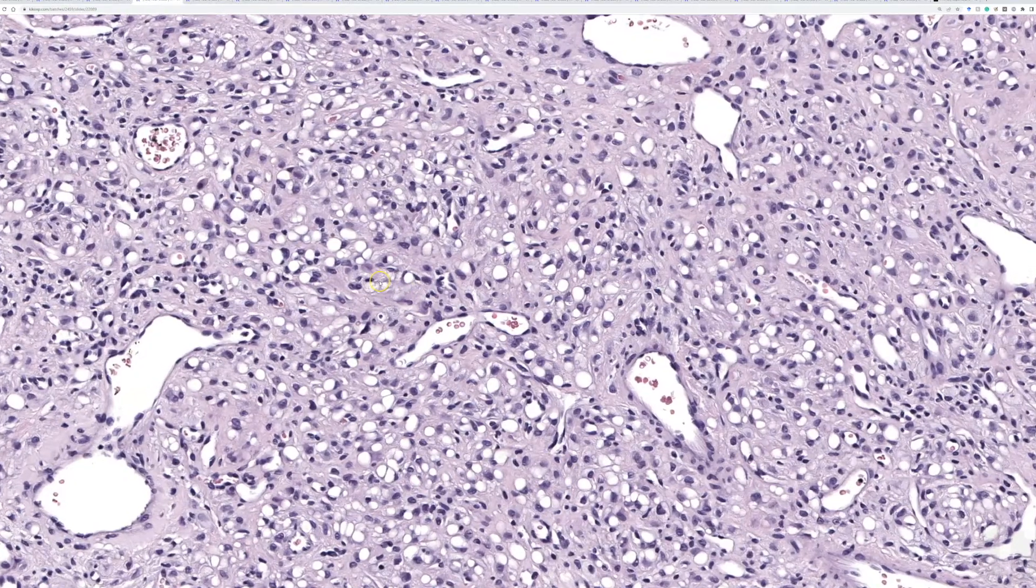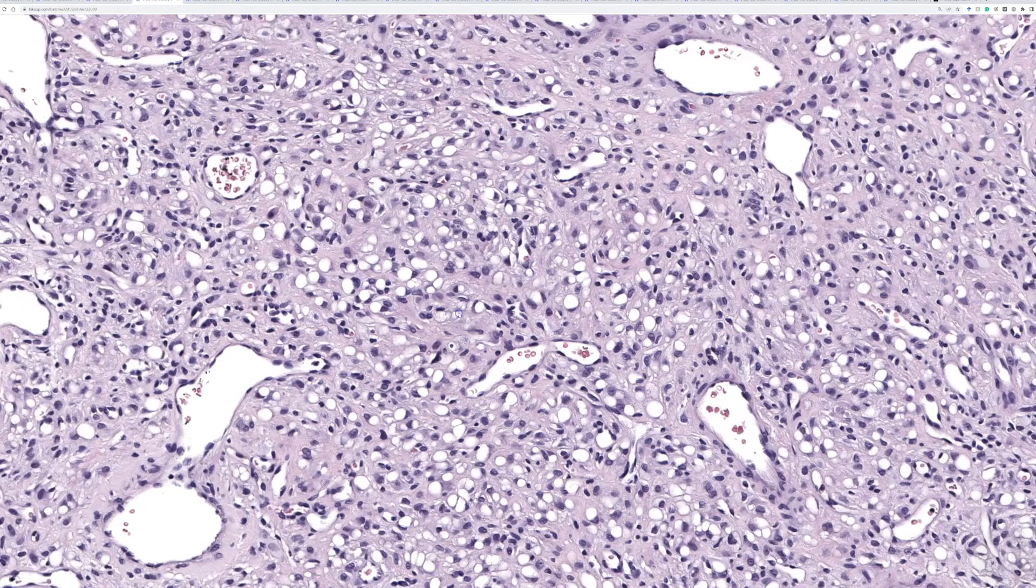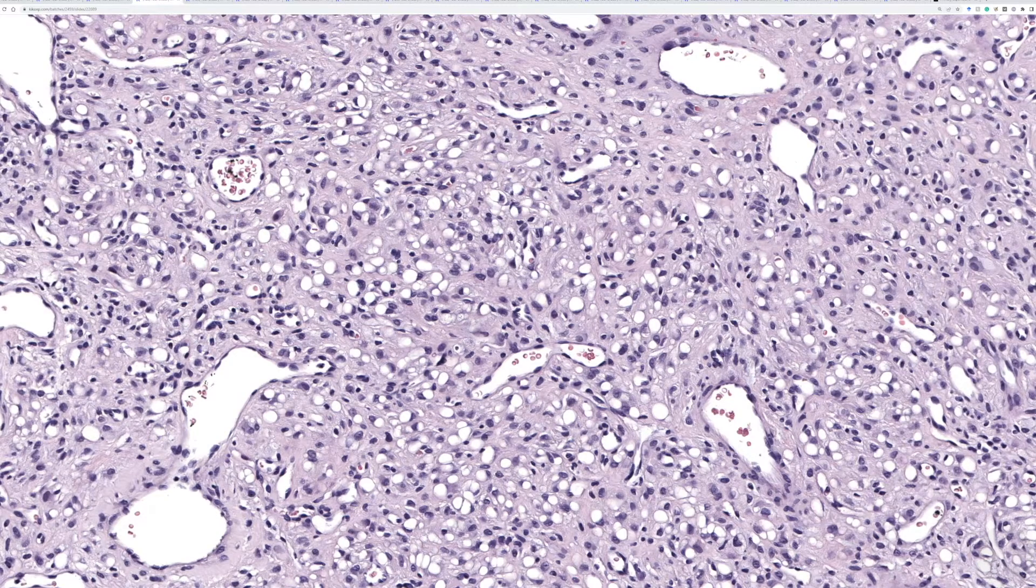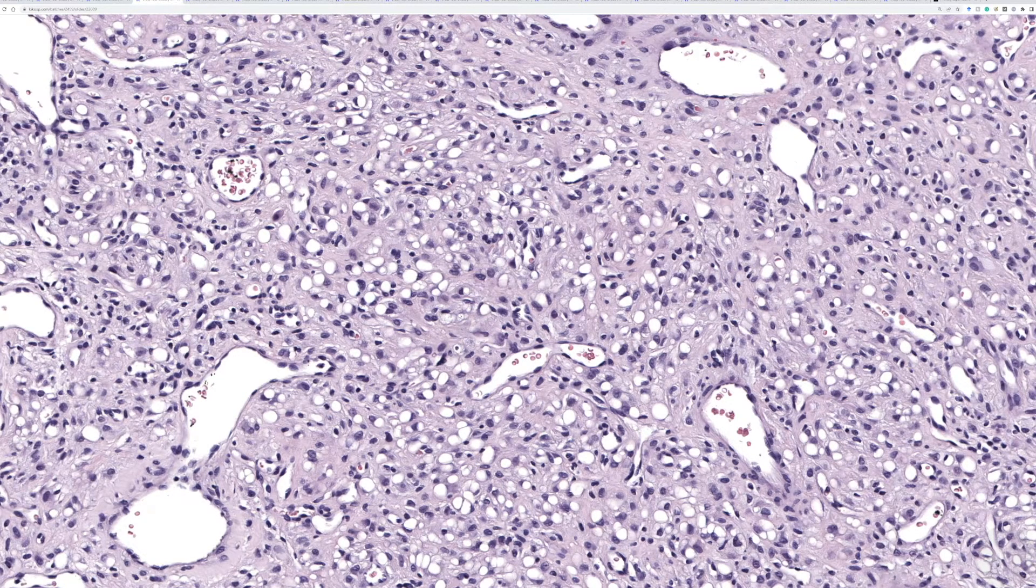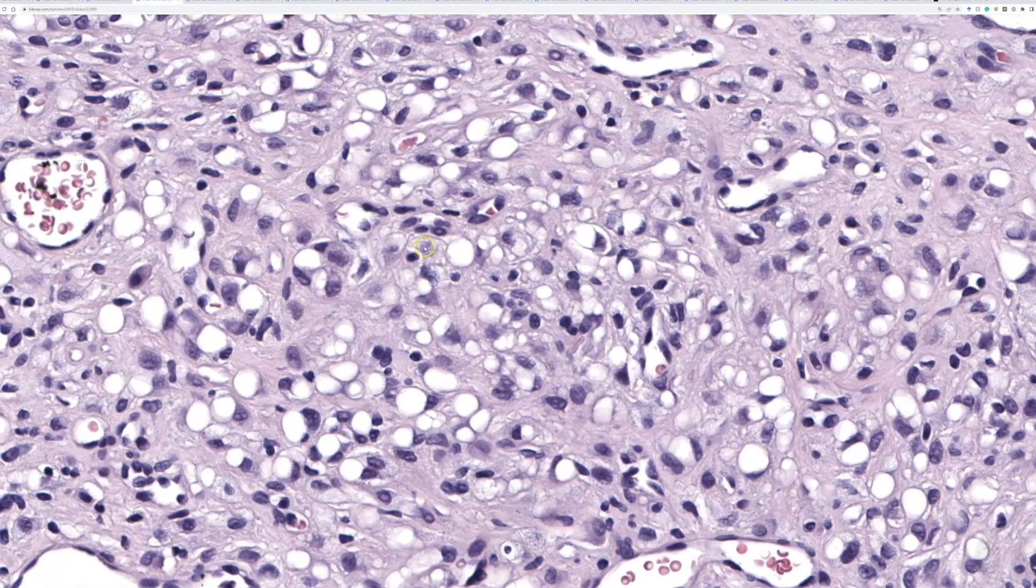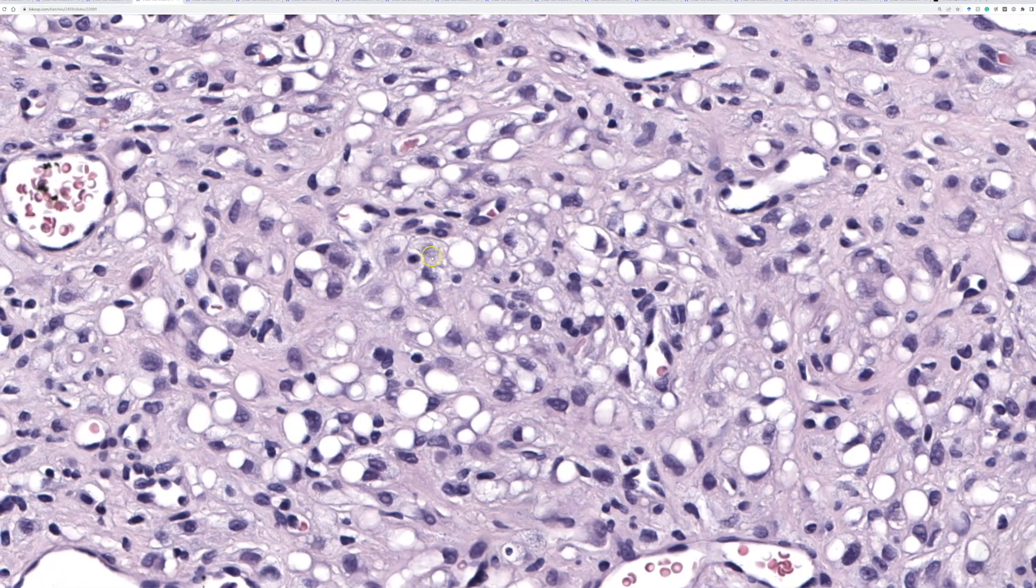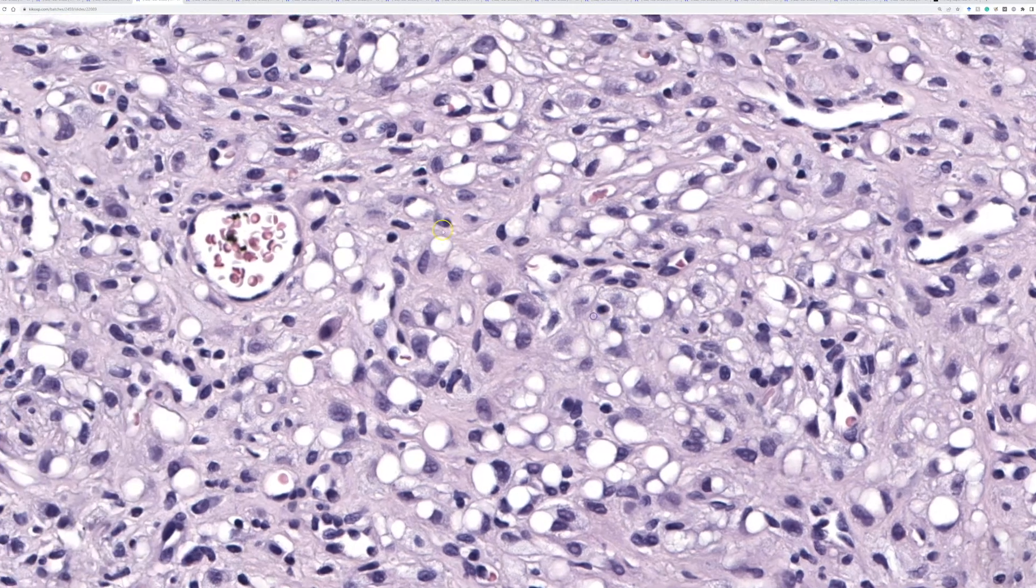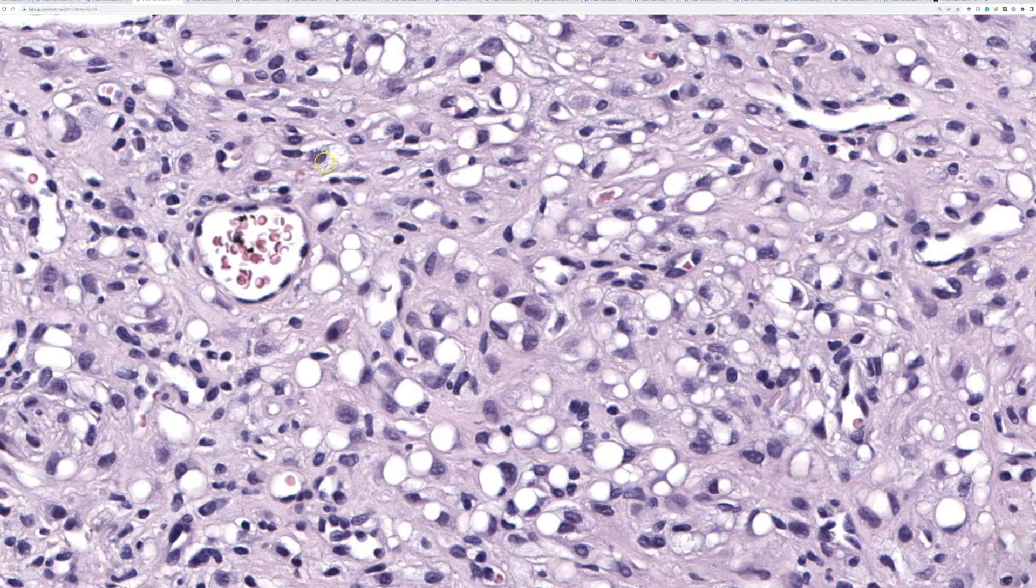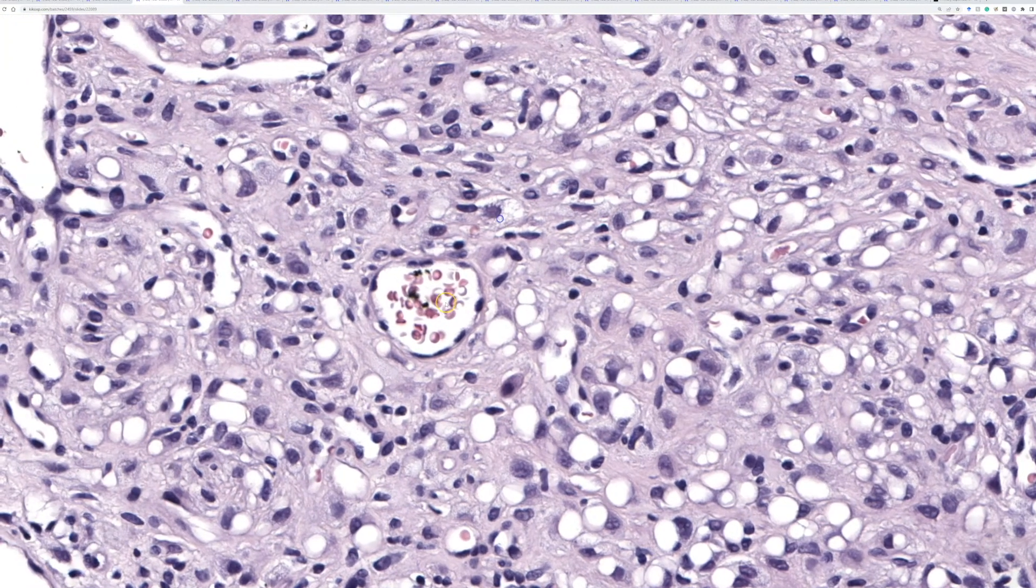The cells here are kind of interesting. Many of them have this cytoplasmic clear vacuolation with peripheral nuclei that give them a signet ring appearance. And then if you look closer, some also have kind of a vaguely foamy or maybe even a granular cytoplasm. I think it's more foamy or xanthomatous in this case personally.